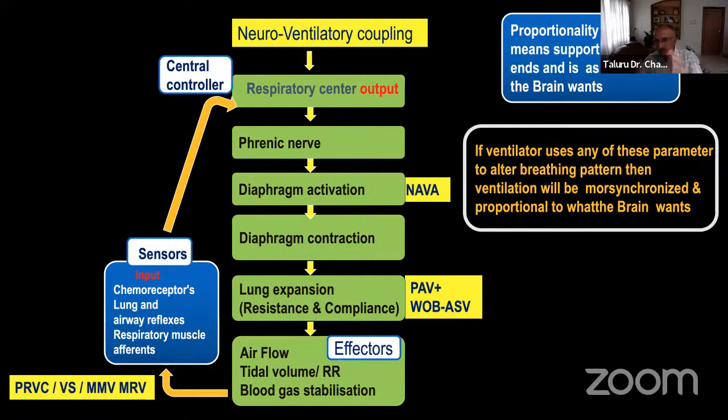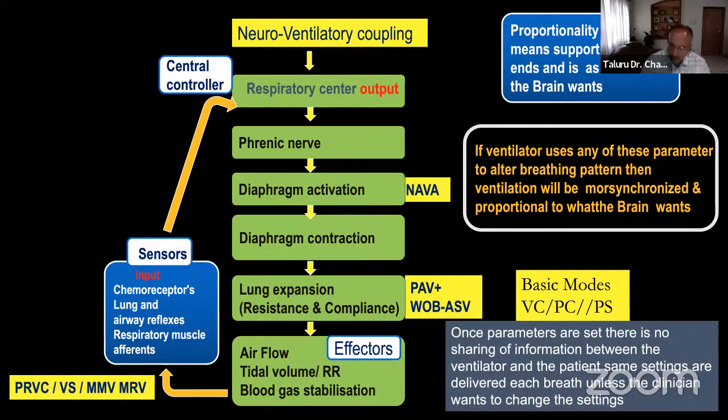These are the only 3 modes which are very, very physiological. And when you talk of basic modes, what you have to understand is once you set a parameter like a tidal volume of 400, unless you change it, 400 ml keeps on going.